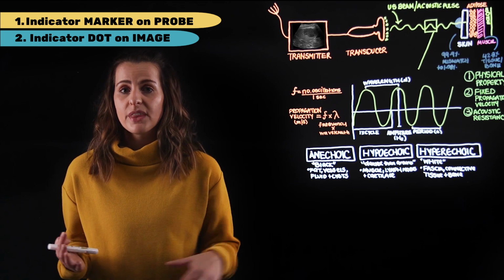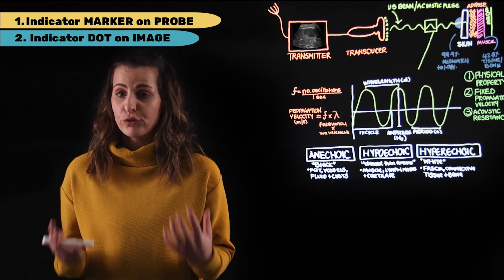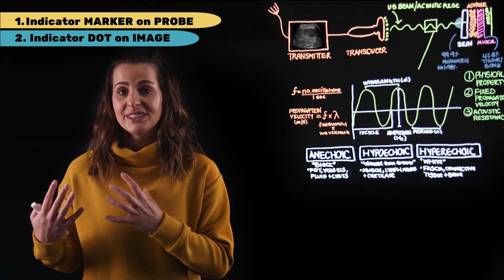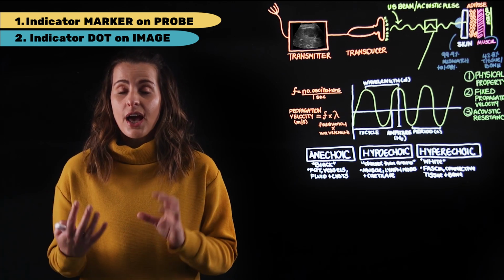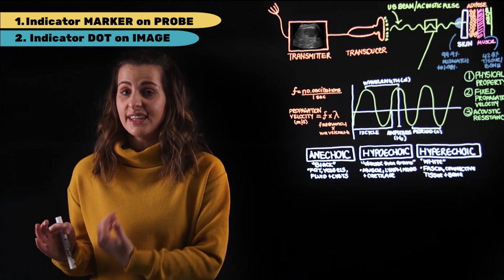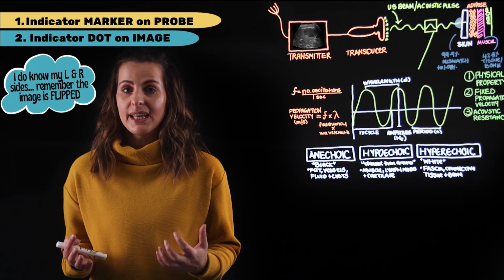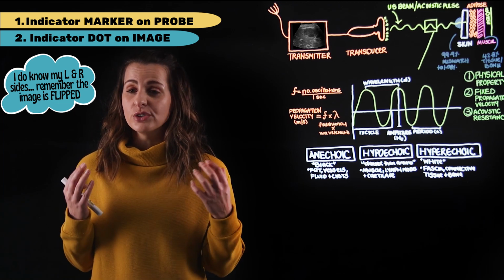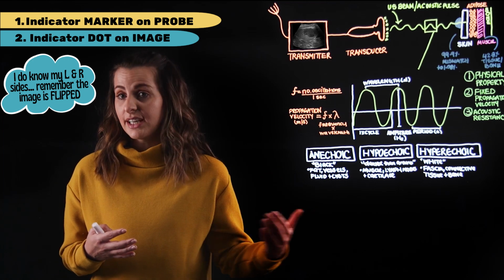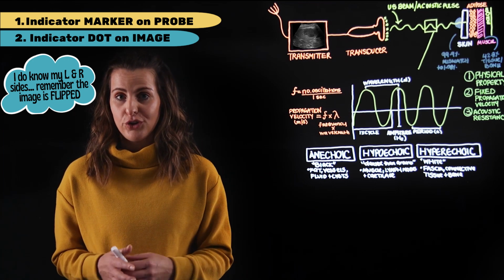You will remember that the heart is shaped like a football or a rugby ball. If we think of the way that it's going to sit in the chest, if we consider that left rotation and angulation towards the apex, this means that we can use our standard anatomical planes to then be able to represent or mimic our common cardiac views.